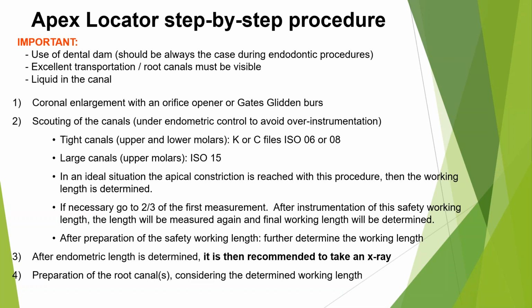I always say that you need something large enough to touch the walls to get a more accurate reading for those molars.